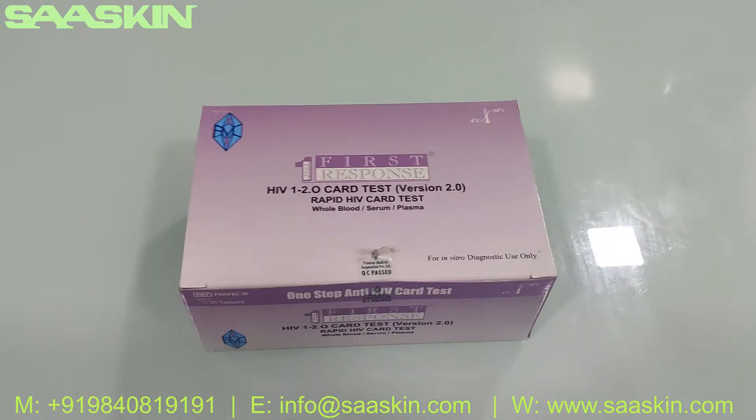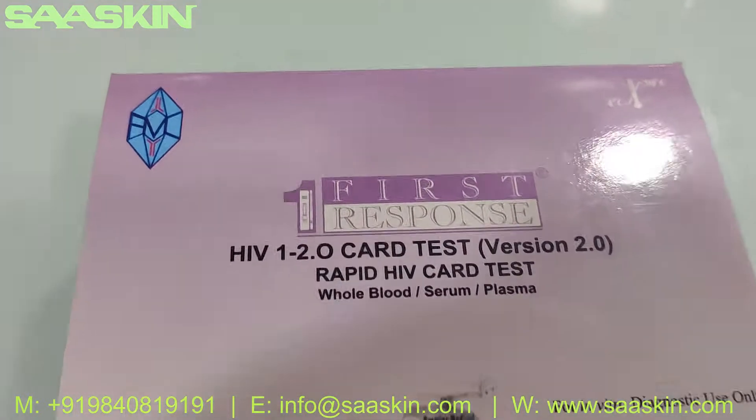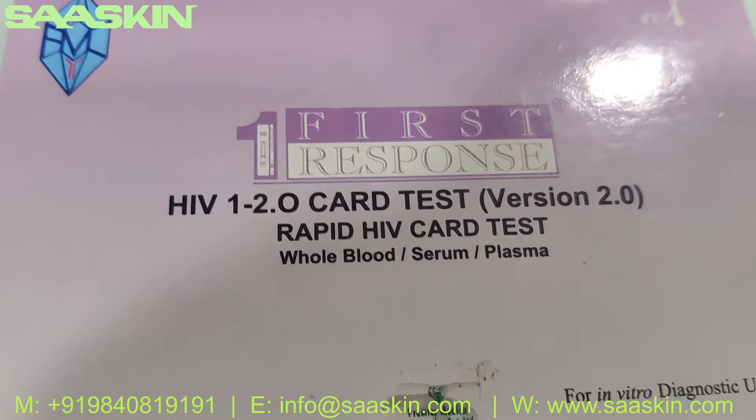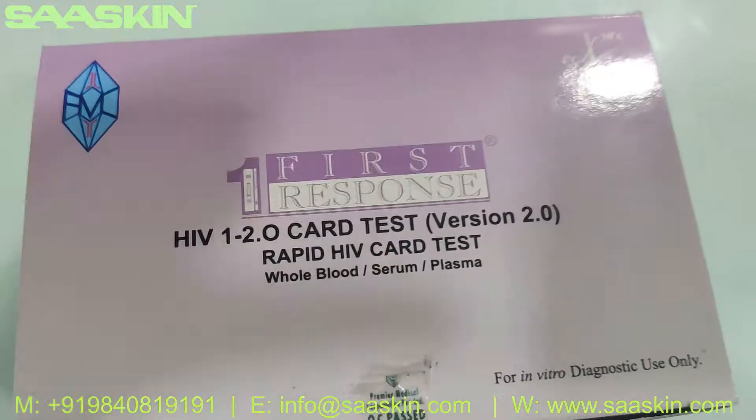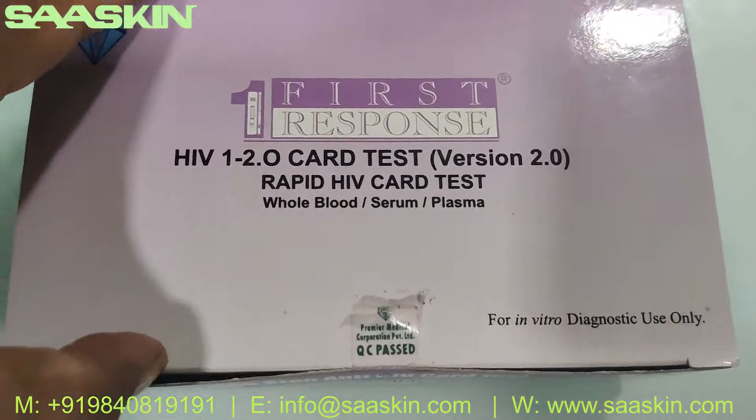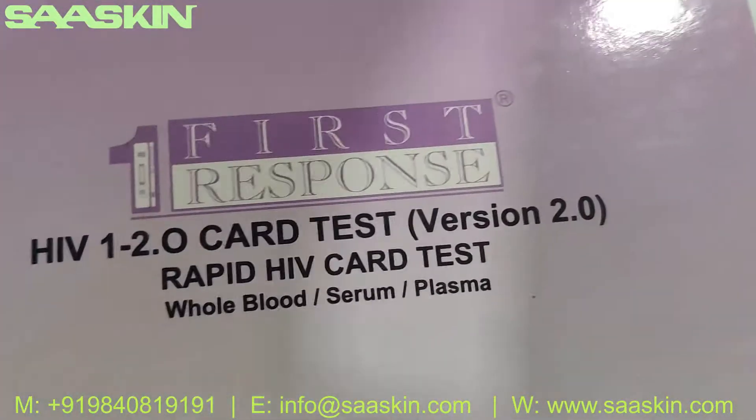Hello everybody. Today we want to see the unboxing of the First Response HIV 1 and 2 card test, which is basically the antibody detection test kit. This is from Premier — the brand name is First Response.